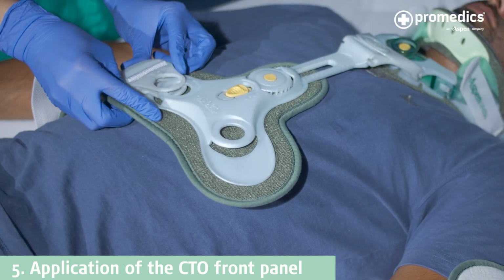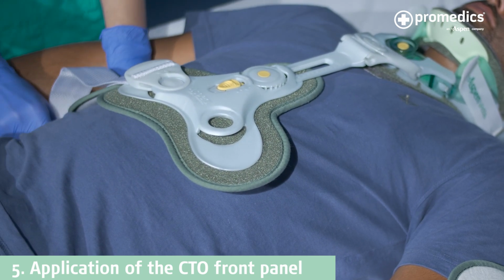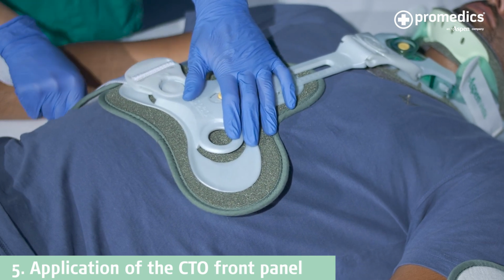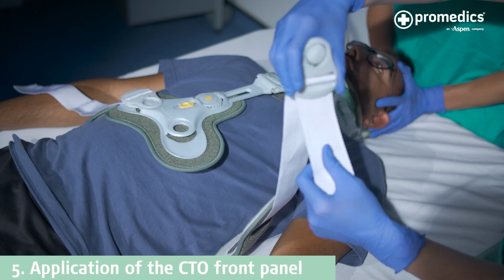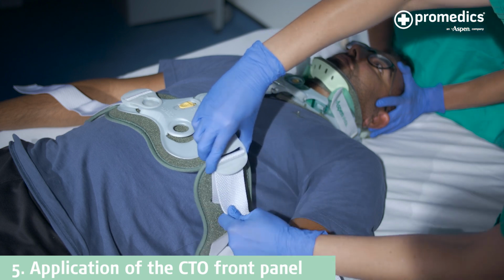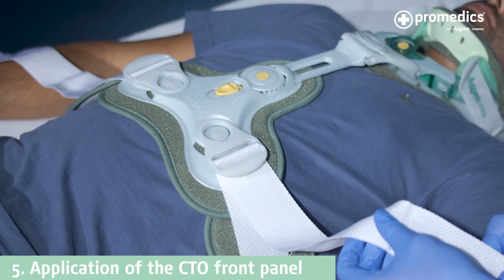Take the clip and place it back into position until it clicks, repeating on both sides. Pull the straps tight so the brace is snug, and tuck the straps in or trim to size.